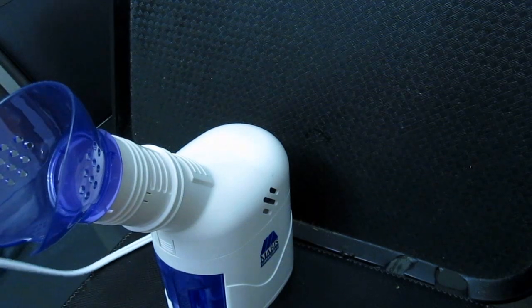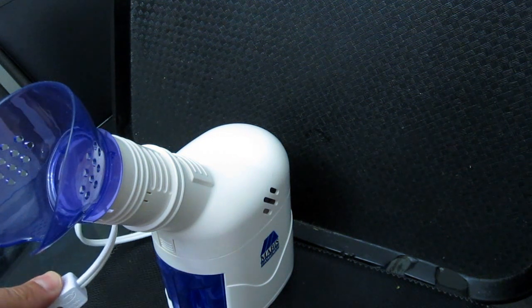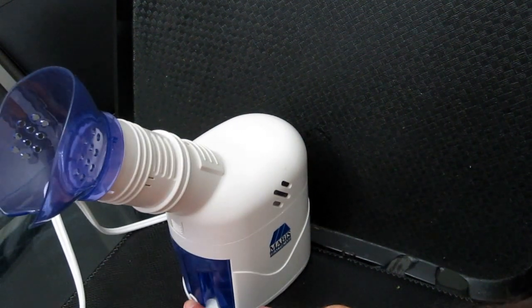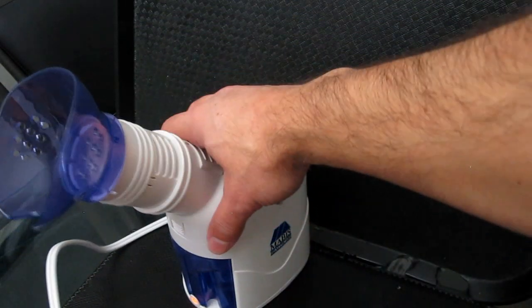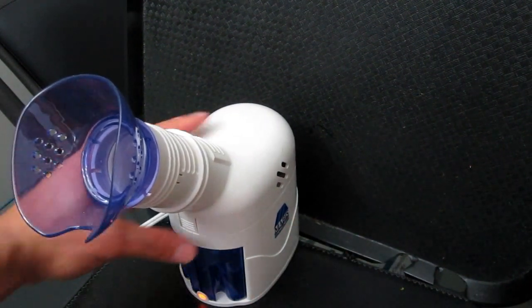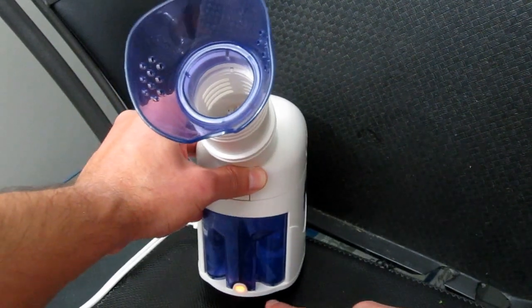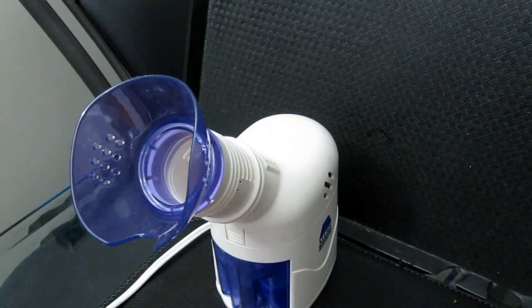One thing that's pretty convenient and handy, there's a little power cord here with an on-off switch, so you don't have to bend down and everything. Also, it does automatically shut off. You'll get a little warning light here, actually. There's the indicator. I don't know if you can see that. Tip it now. It's not really showing up on here, but it is orange. And you can hear it starting to percolate.